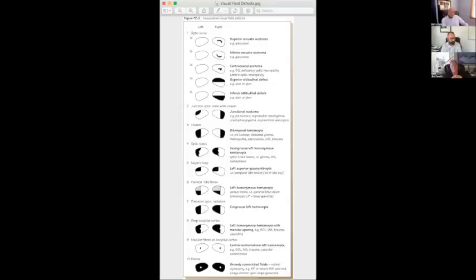That's number one. Because we know some of these etiologies can really affect the patient's life. So you want to indicate an MRI, you want to indicate an OCT, because what we thought was very uncommon, which is transsynaptic degeneration, now, with the advent of the OCT, we know is more frequent than we thought. It is not unusual to see post-geniculate nucleus strokes with ganglion cell defects. So an OCT should be another imaging test used in addition to the MRI.